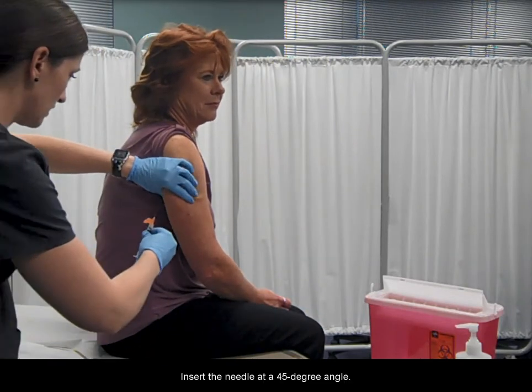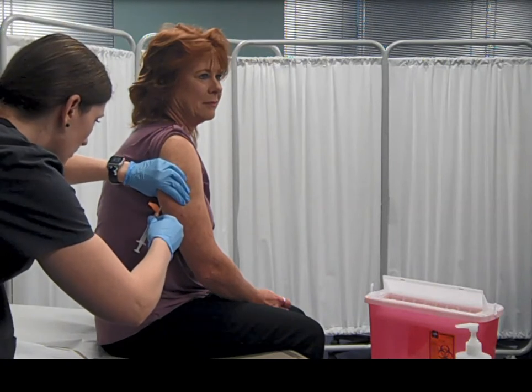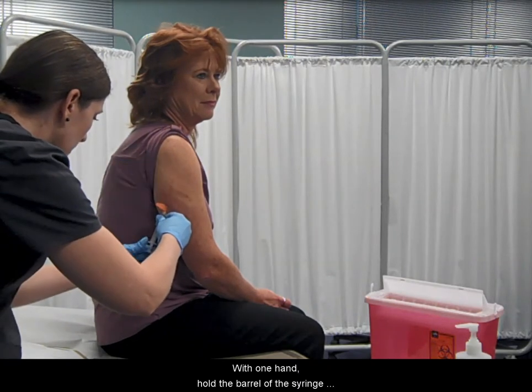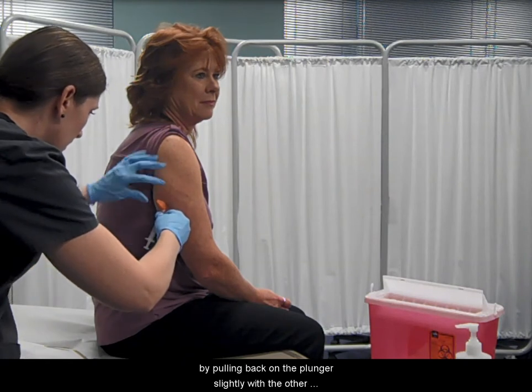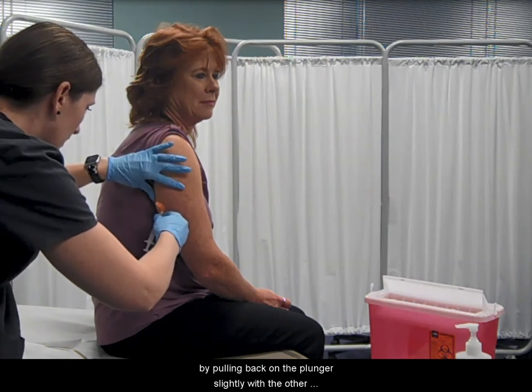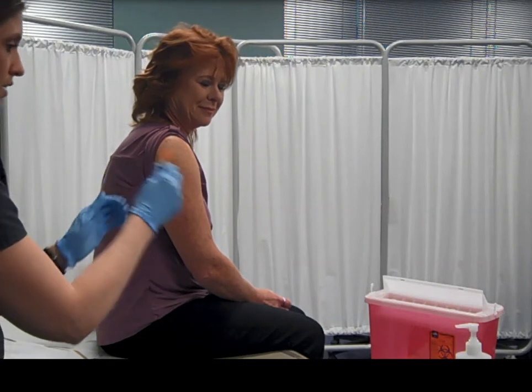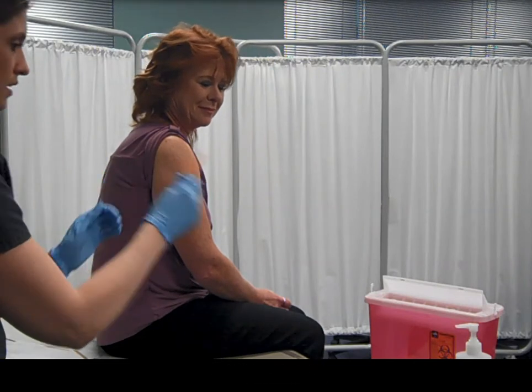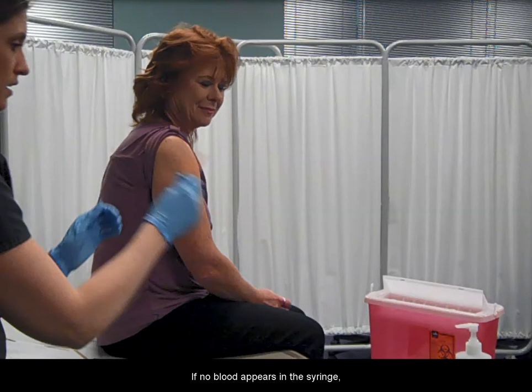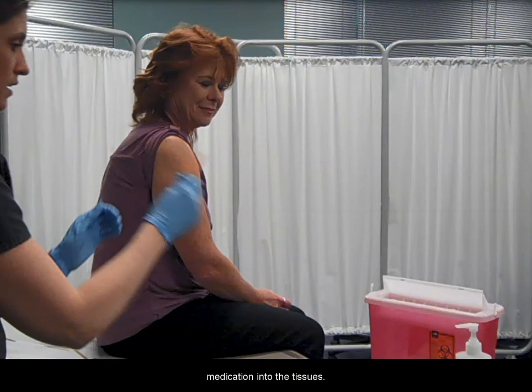Insert the needle at a 45 degree angle. With one hand, hold the barrel of the syringe while pulling back on the plunger slightly with the other hand to make sure a blood vessel has not been penetrated — this is known as aspirating. If no blood appears in the syringe, proceed by slowly pushing down on the plunger to expel medication into the tissues.